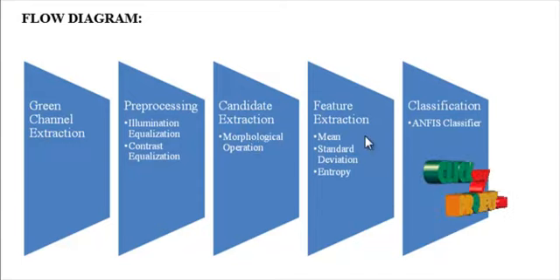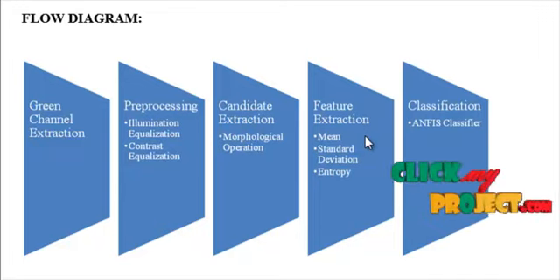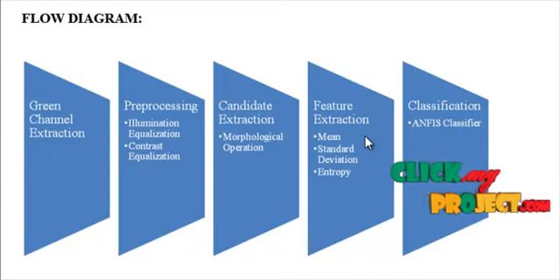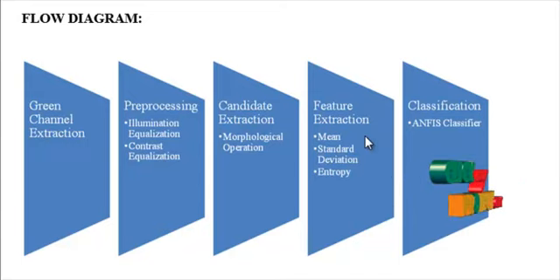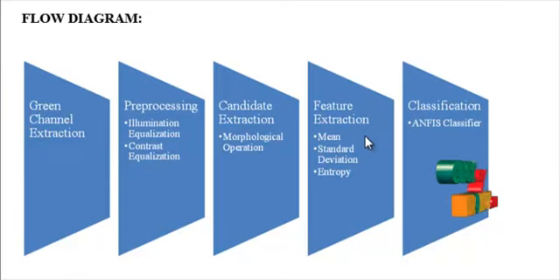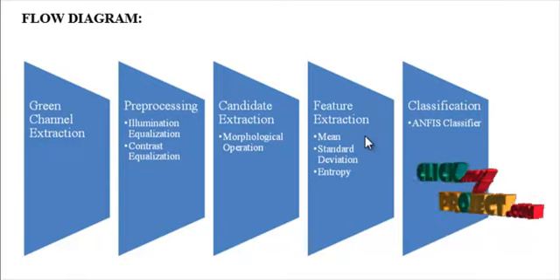The next process is the feature extraction process. The statistical features were extracted from the images. Statistical features were more helpful for the identification of the exact parameters from the input medical images, and hence the statistics like mean, standard deviation and entropy were all measured.